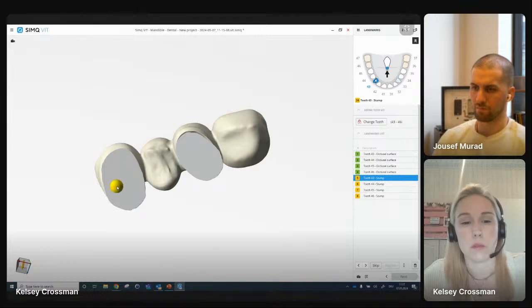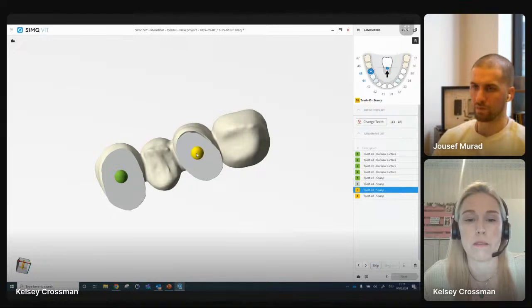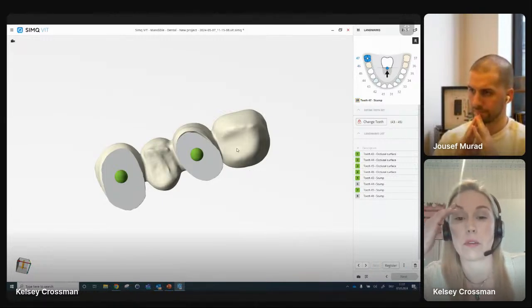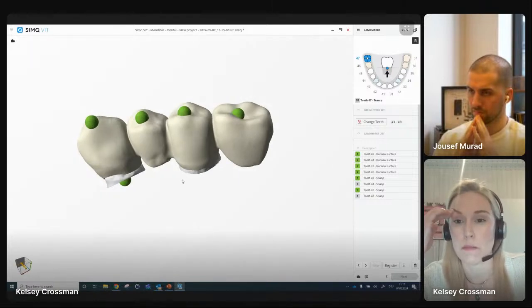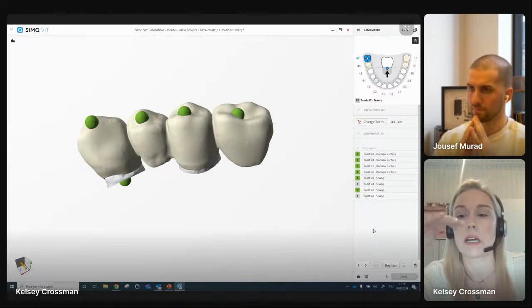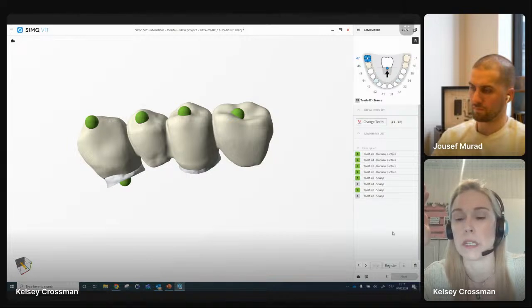Then what's important in this workflow: you have a stump here, but you don't have a stump here, so you need to skip. And what's important is, like that previous maxillary subperiosteal implant you saw, there was a portion of the maxilla that is missing. Sometimes with these surgeries you're not going to have a place to set landmarks, but it's nice because with these workflows, if you need to skip an area, it doesn't affect the quality of the simulation, because sometimes they're just not there to register.